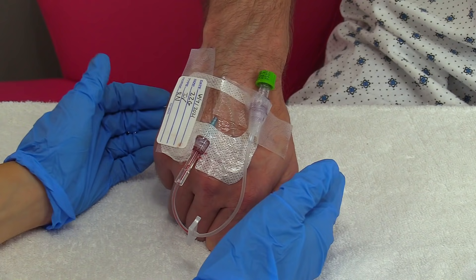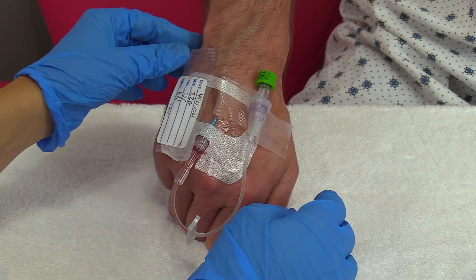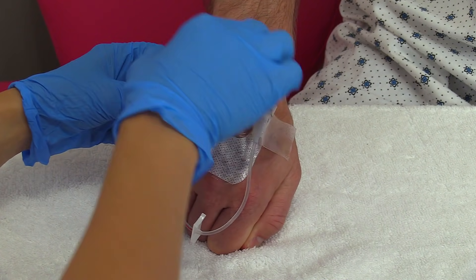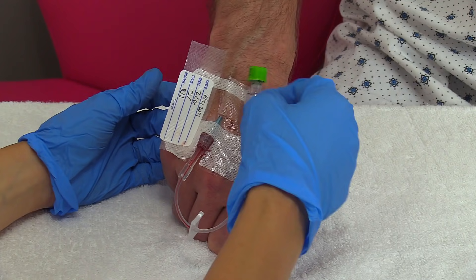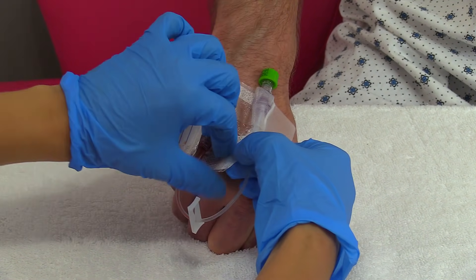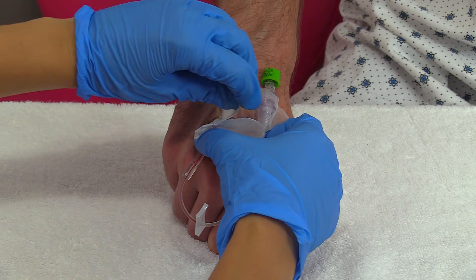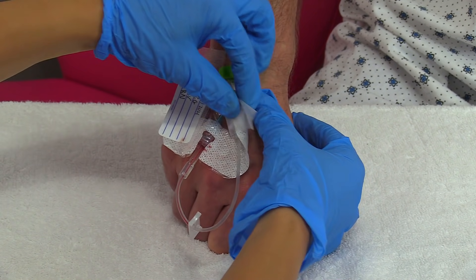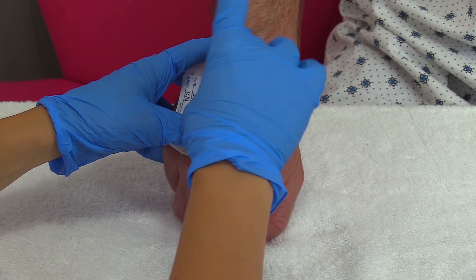Now I'm going to remove the IV — it's very simple. We're going to remove all the tape from the IV first, just lightly tearing it off. You want to stabilize the IV as well because you don't want to just rip that out.